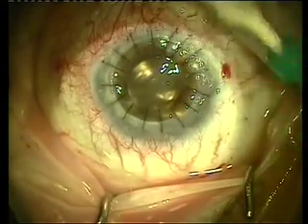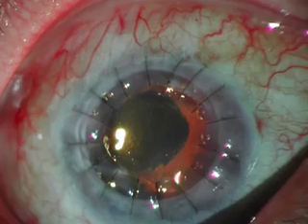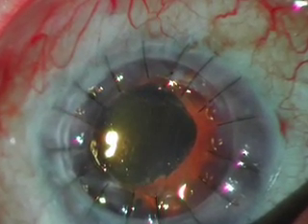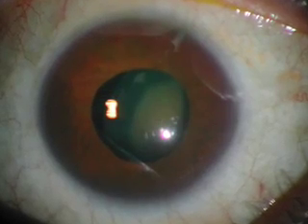The Artisan lens gives the ability in these patients — we have published our experience in the Journal of Cornea — of a deeper chamber. You can see the patient postoperatively with a deep chamber, a lens flush with the iris and away from the donor cornea, maximizing the possibility of graft survival.